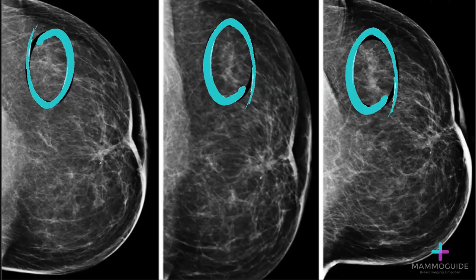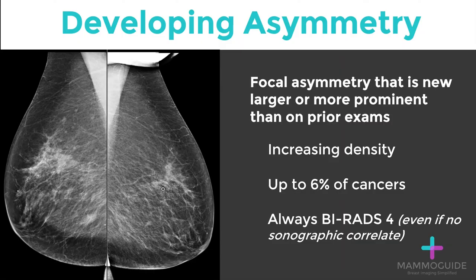Serial craniocaudal mammograms from several consecutive years demonstrate increasing density in the lateral left breast, referred to as a developing asymmetry. Developing asymmetries are essentially focal asymmetries that are new, larger, or more prominent than on prior exams. This increasing density can be seen in up to 6% of breast cancers. This finding should always be given a BI-RADS category 4, even if there is no sonographic correlate.